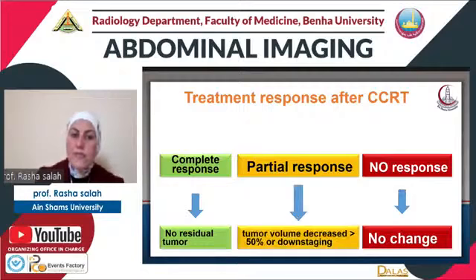Partial response is categorized when the tumor volume decreased by more than 50% of its volume, or there is downstaging of the tumor. If there was previously a violation of the circumferential resection margin, and then after treatment the margin became negative, then this is considered a partial response.